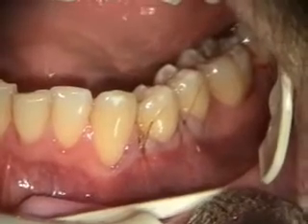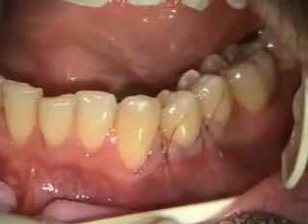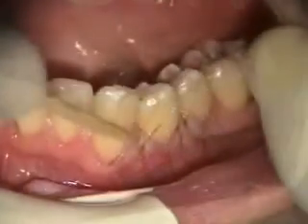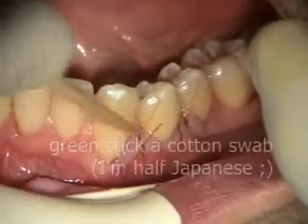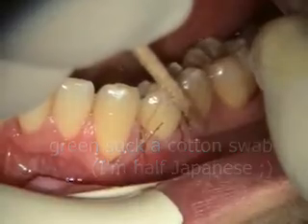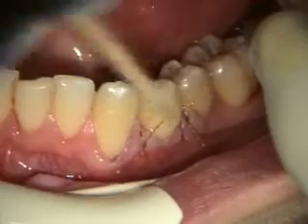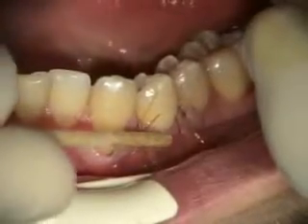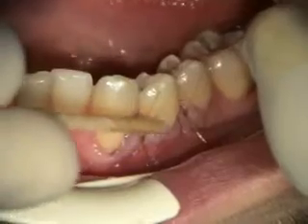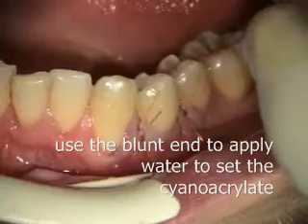That's our final suturing, and I don't think we're going to need a pack. I'm just going to put some cyanoacrylate on the edge. I'm applying the cyanoacrylate here. I'm putting some water on it — seems to help set it.